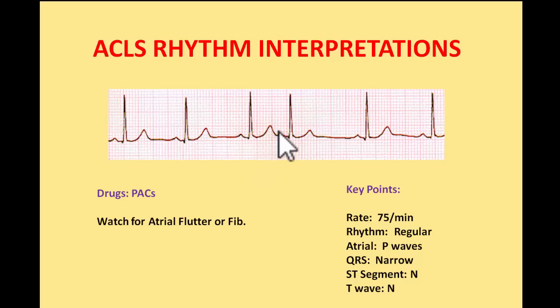Then here is what looks like an atrial beat, but it's coming much earlier than the expected next beat, which should be somewhere here. So this is a premature atrial beat. This is a premature atrial beat because it resembles the sinus beat, but the P wave is a little bit distorted compared to the sinus P waves, and it is occurring prior to the next sinus beat.